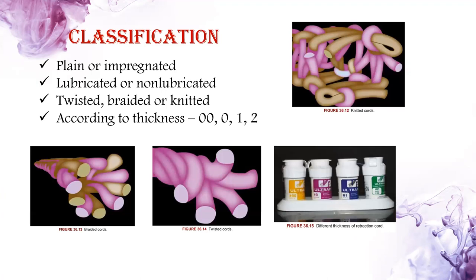Classification: plain or impregnated, lubricated or non-lubricated, twisted, braided or knitted, and according to thickness. These are the different thicknesses available.